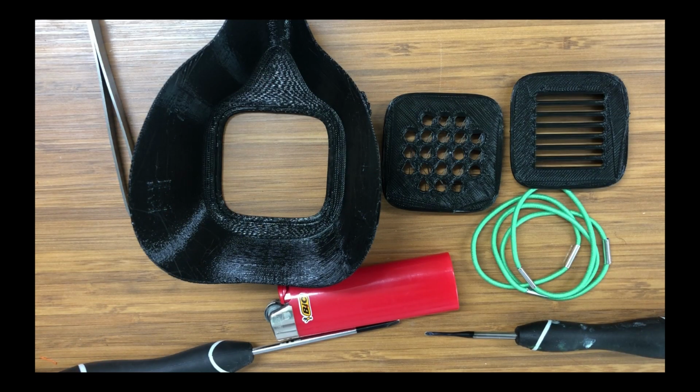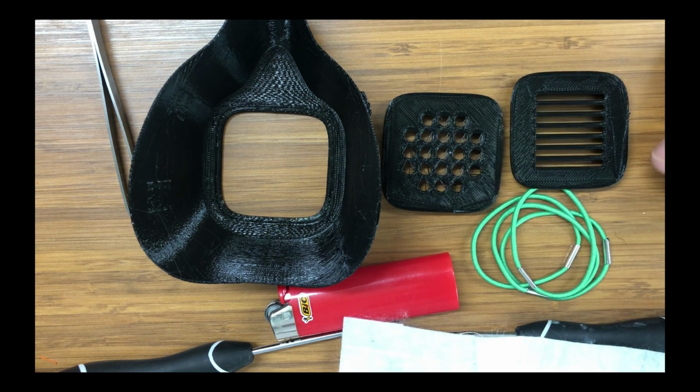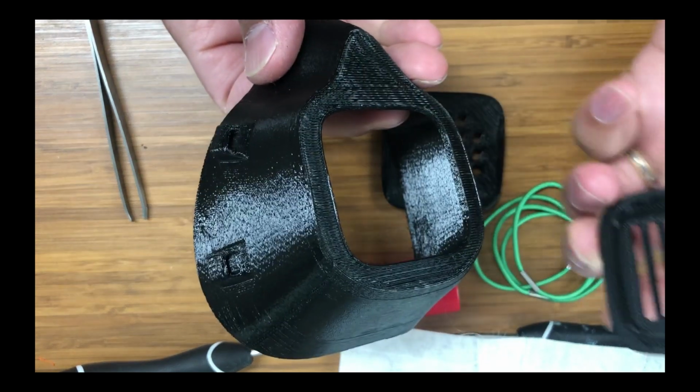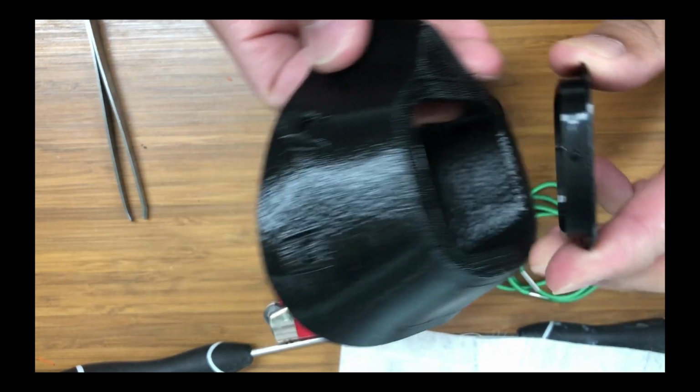All right, guys, welcome back. Here's my station with all the things that I need to assemble my face mask. All right. So we're going to start out with some tips. So this is my face mask. This is one of the connectors.